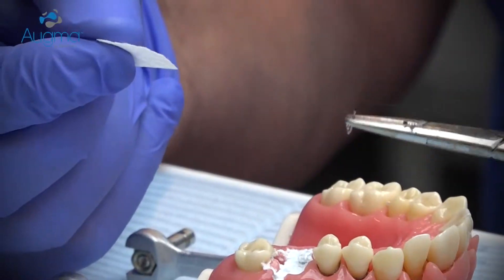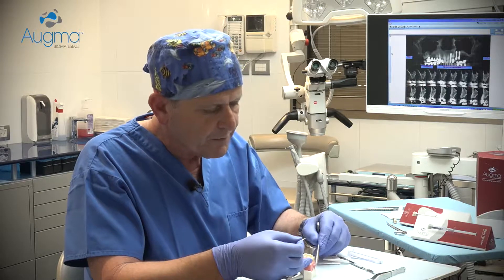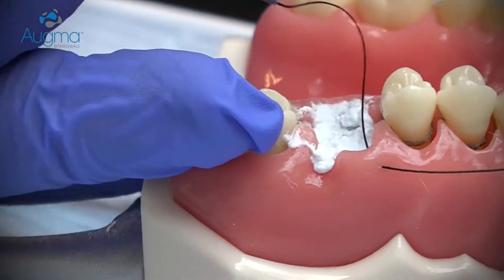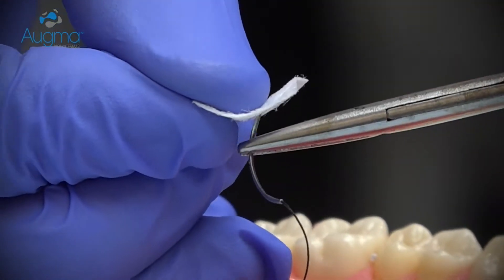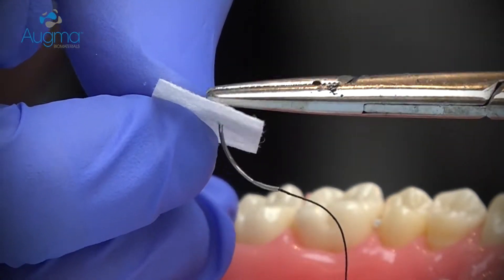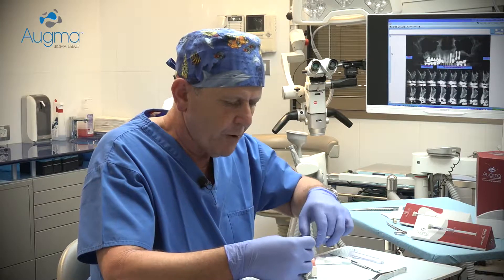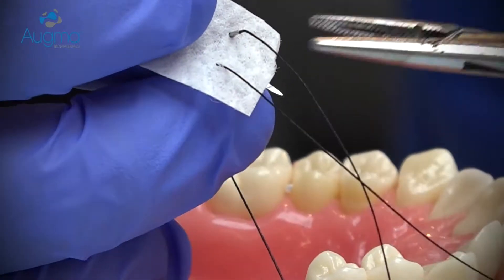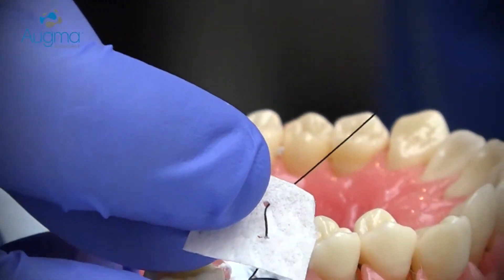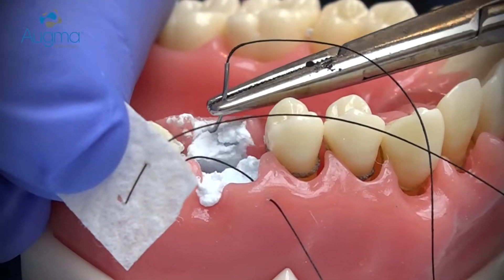The technique is as follows. Hold the collagen sponge in your hand. Insert the needle from the buccal aspect, going to the bottom of the collagen sponge, from up to down. Then insert the needle into the lingual aspect.